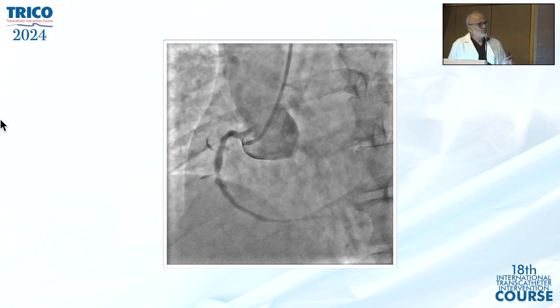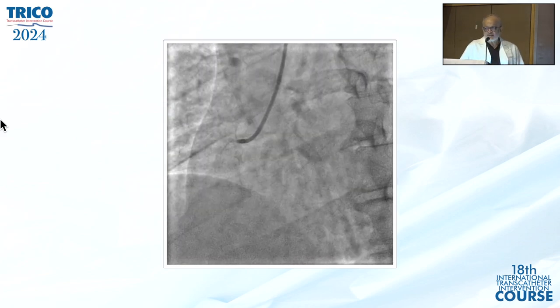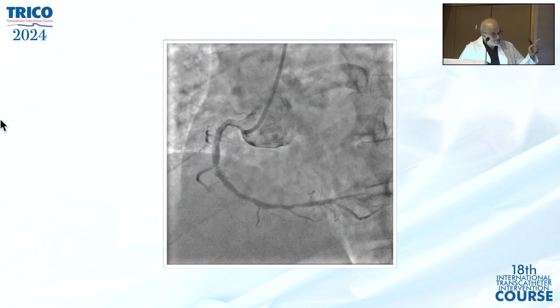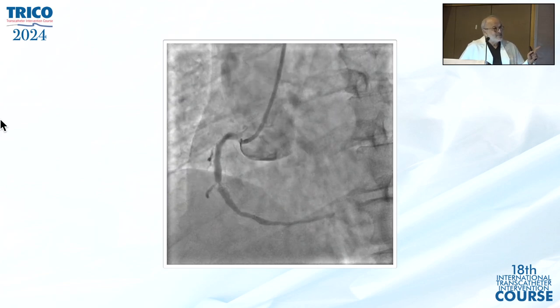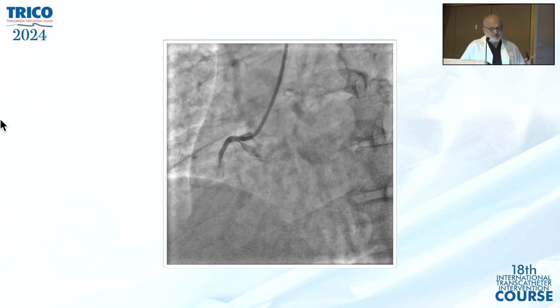Run through, simply could not be passed. Whisper, simply could not be passed. What is the third choice? In this case, I tried it with a microcatheter. No, I could not. CTO wires. Yes.